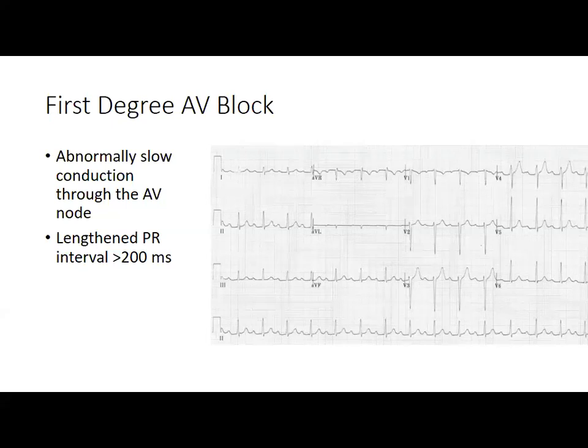I can't think off the top of my head of ever having seen a pacemaker put in for first degree AV block that was symptomatic, just because it's so unlikely and so hard to prove.